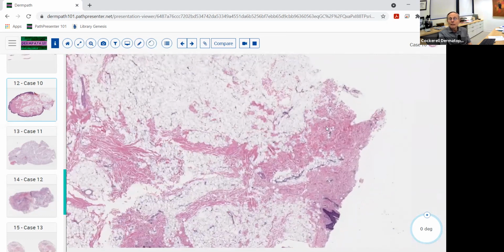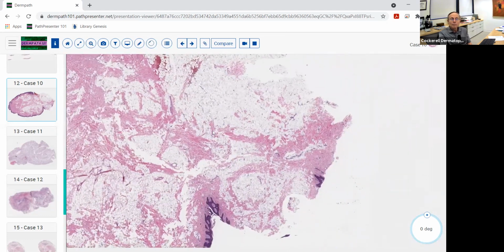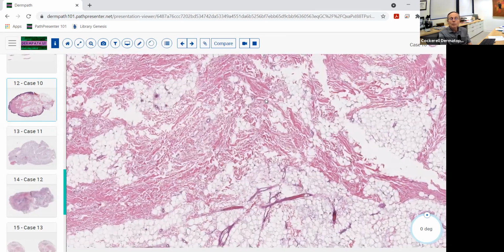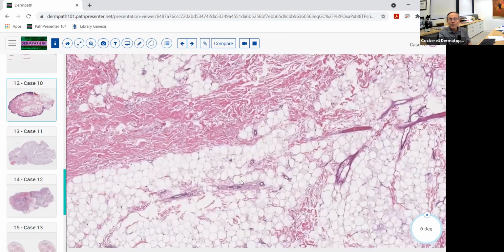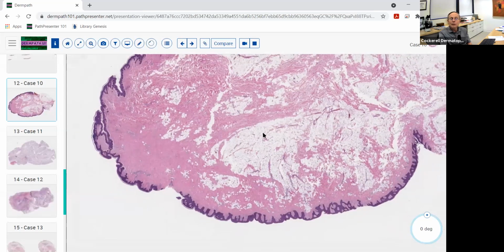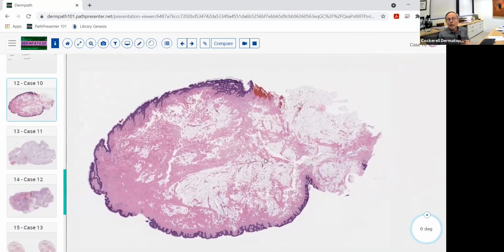There's also some dermis or soft tissue or fibrosis in there, fibrous tissue formation as well. Then up in here, you've got all this fat that looks like it's present in the mid-reticular dermis here, which really shouldn't be there. In this example of a nevus lipomatosis, the differential diagnosis is just a large skin tag with a lot of fat in it. A lot of times we see a person coming in with just a single papule on the chest, you biopsy it, and it looks like this with fat, and it's just a skin tag with fat in it.